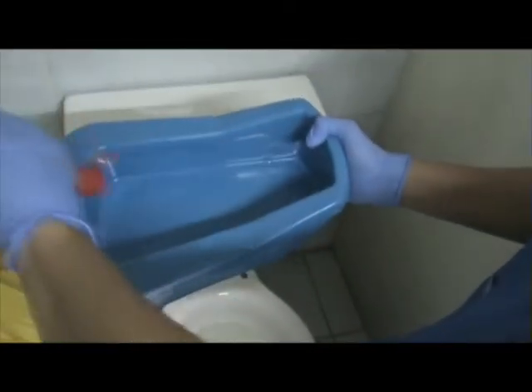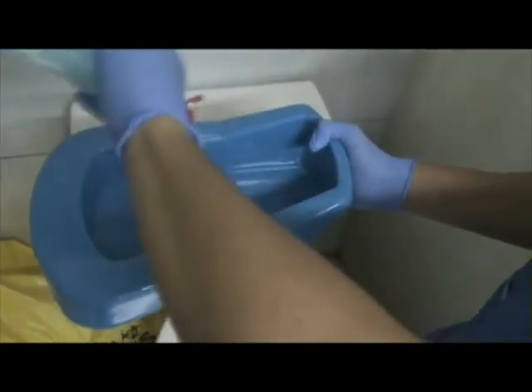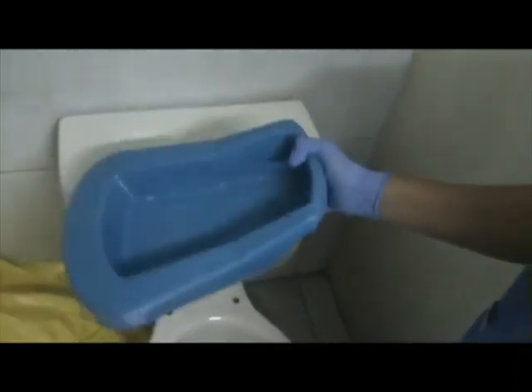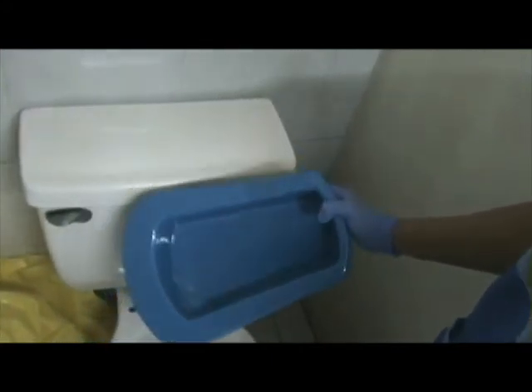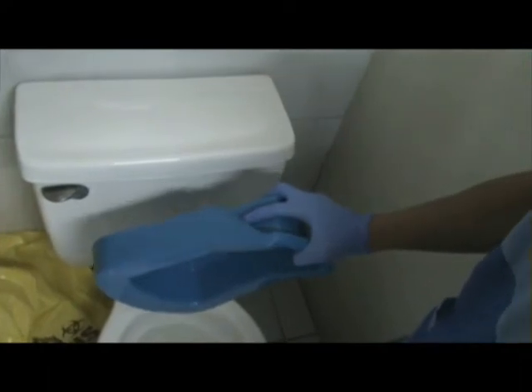Wash the bedpan urinal with liquid soap and then rinse with water. Pour enough amount of low-level disinfectant or precept for the bedpan urinal just enough to cover soiled surfaces. Let it sit for about 2-5 minutes and then rinse again with water.